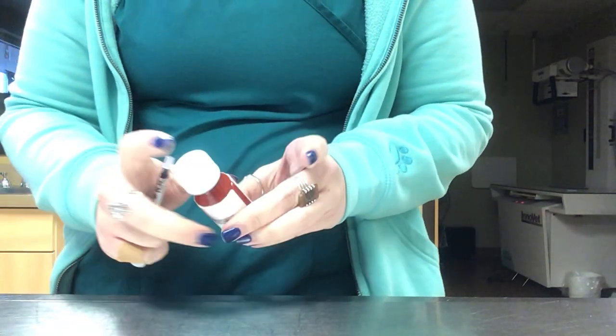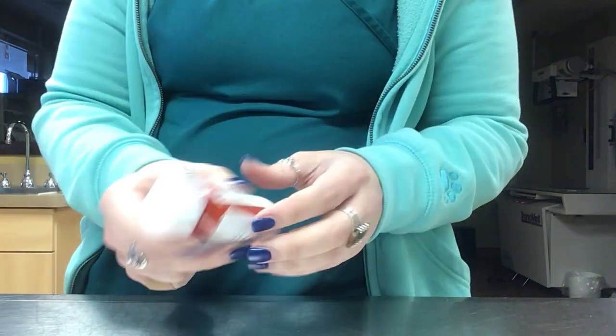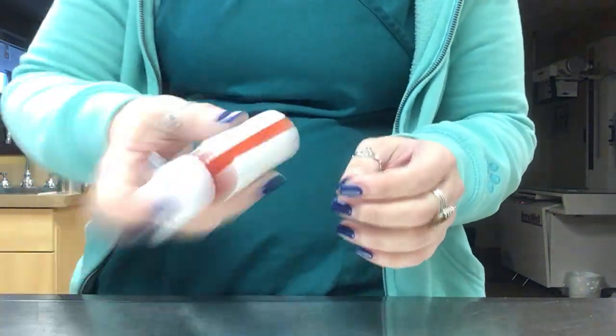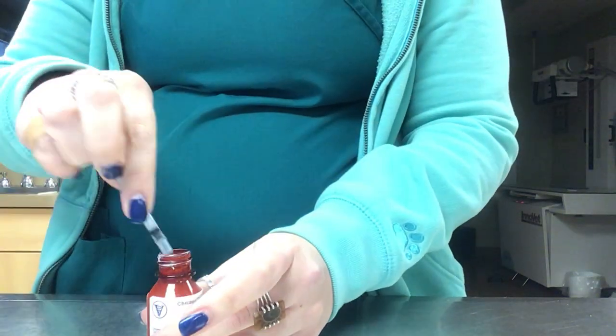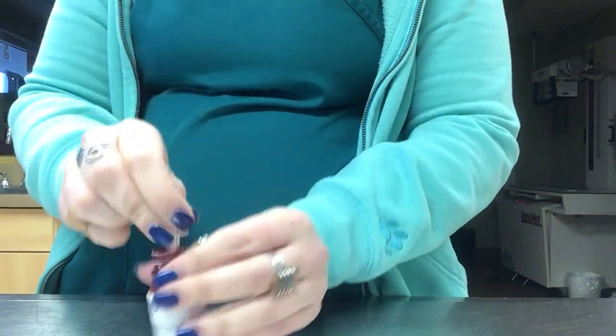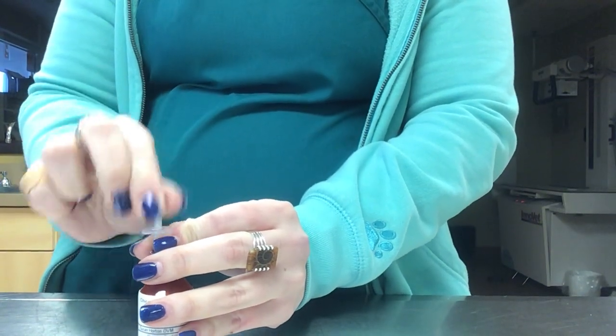To draw up your medication, shake the bottle really well first. You may have a different type of bottle but that shouldn't matter. Put the syringe in all the way down to the bottom, then pull the plunger in and out several times to get rid of the air bubbles.